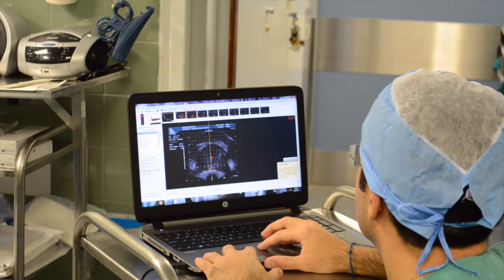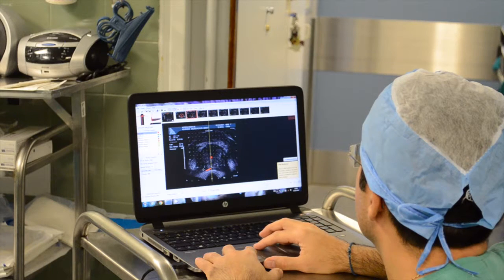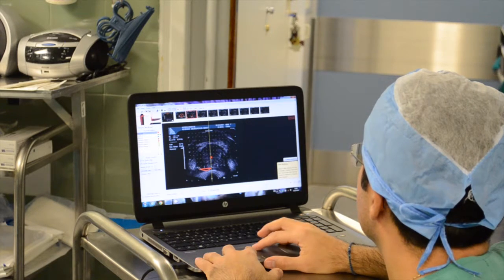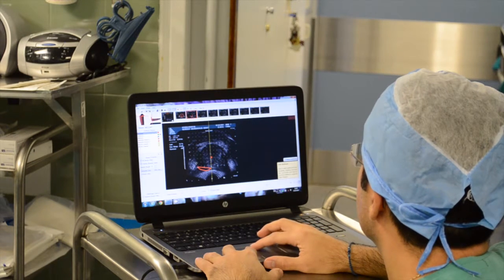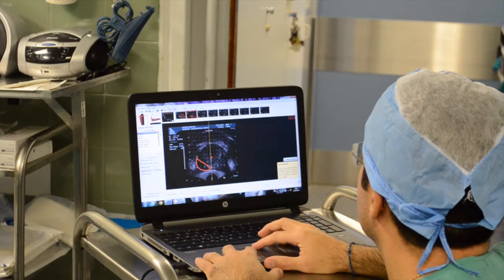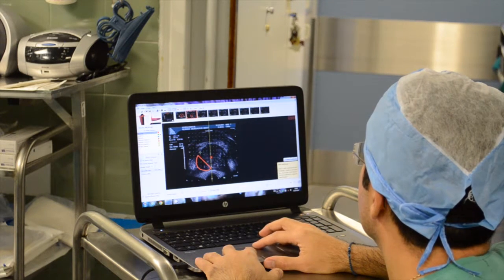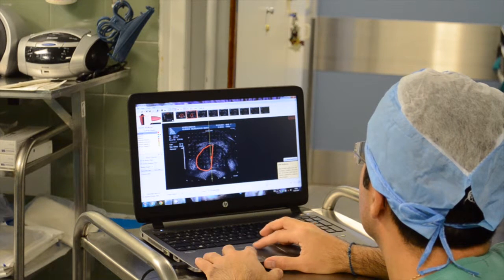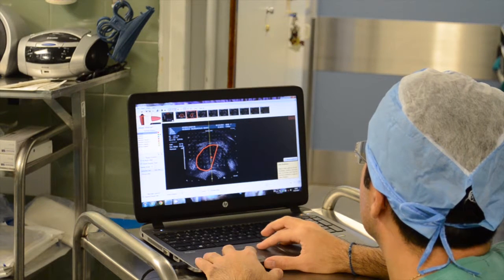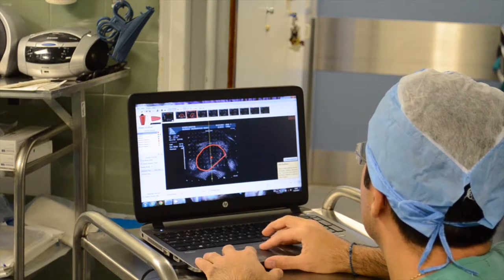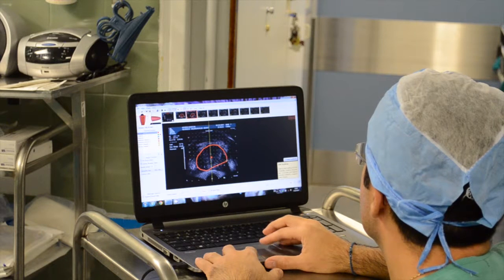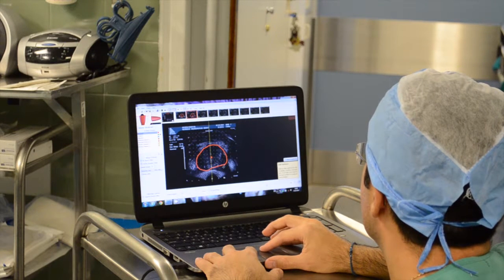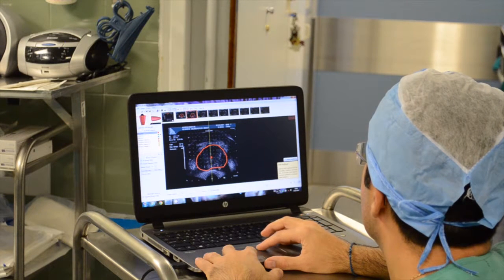The urologist or his assistant sits at the laptop and uses the tools of the program to contour the prostate, urethra, and rectum. The contouring starts at the base of the gland and works its way down to the apex until the entire gland is rendered in three dimensions.